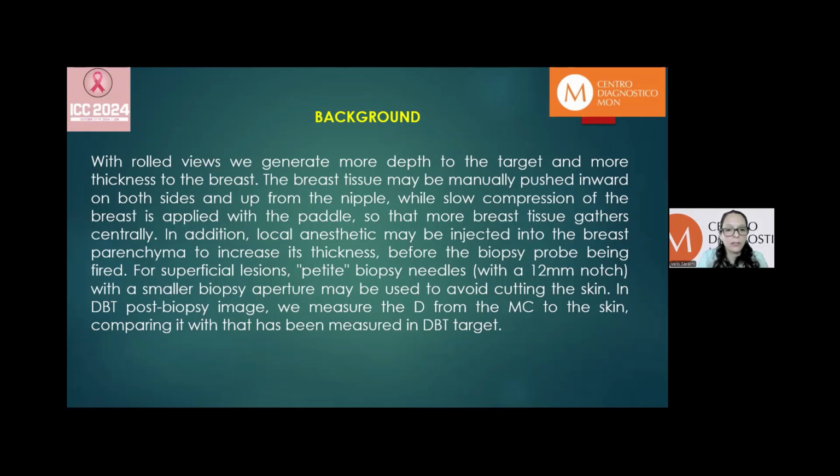In addition, local anesthetic may be injected into the breast parenchyma to increase its thickness before the biopsy probe is fired. For superficial lesions, petite biopsy needles with 12 millimeters of notch with a smaller biopsy aperture may be used to avoid cutting the skin.